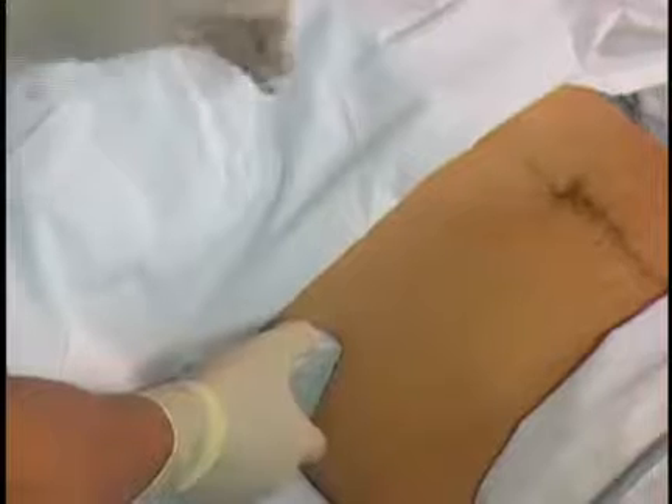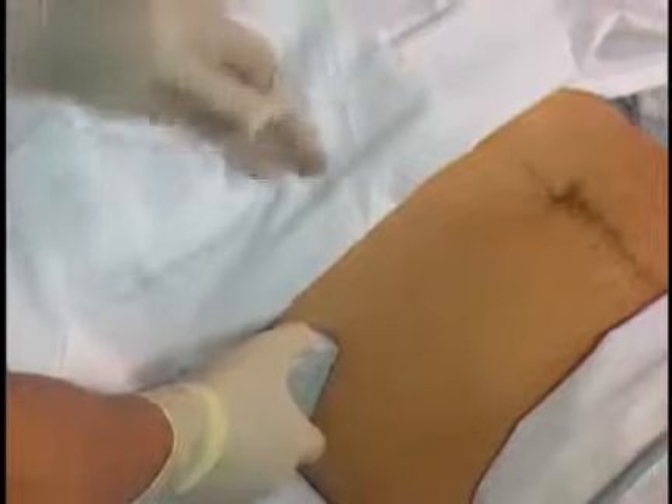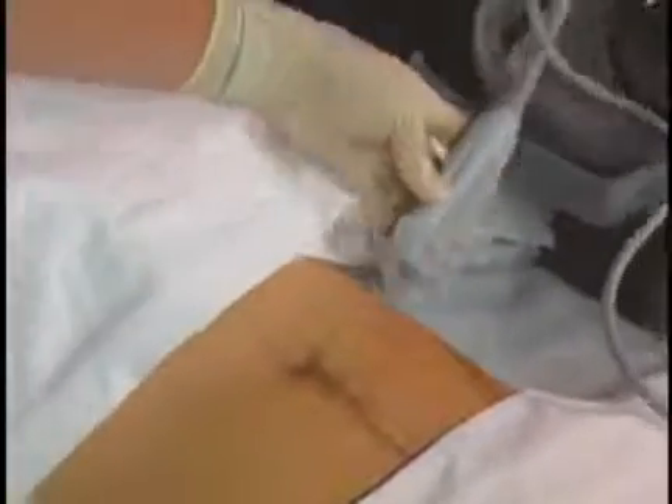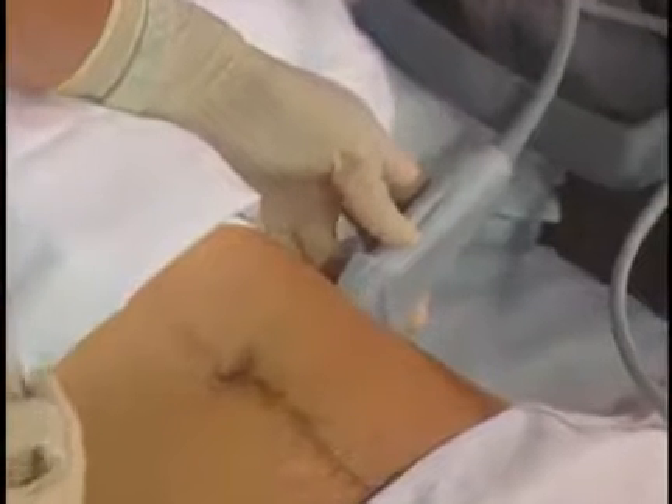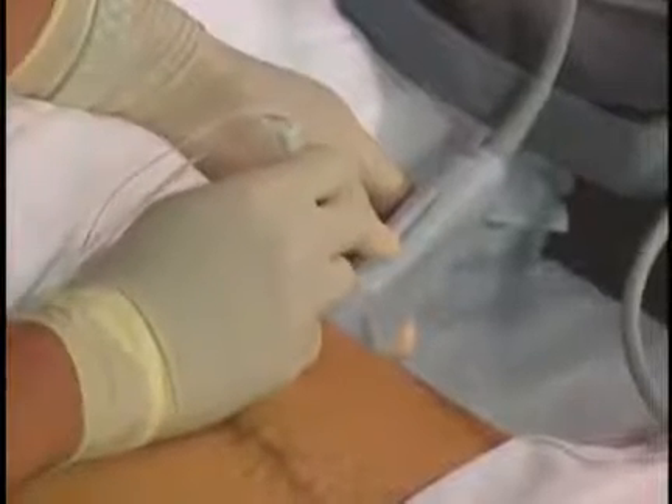For bilateral blocks for midline surgeries, I'll stay on the same side and just move my hands over in this direction, so I don't need to switch the machine to the other side. I'll just lean over the patient, get the same three muscle layers, and advance the needle like this in the middle of the probe, just like previously.